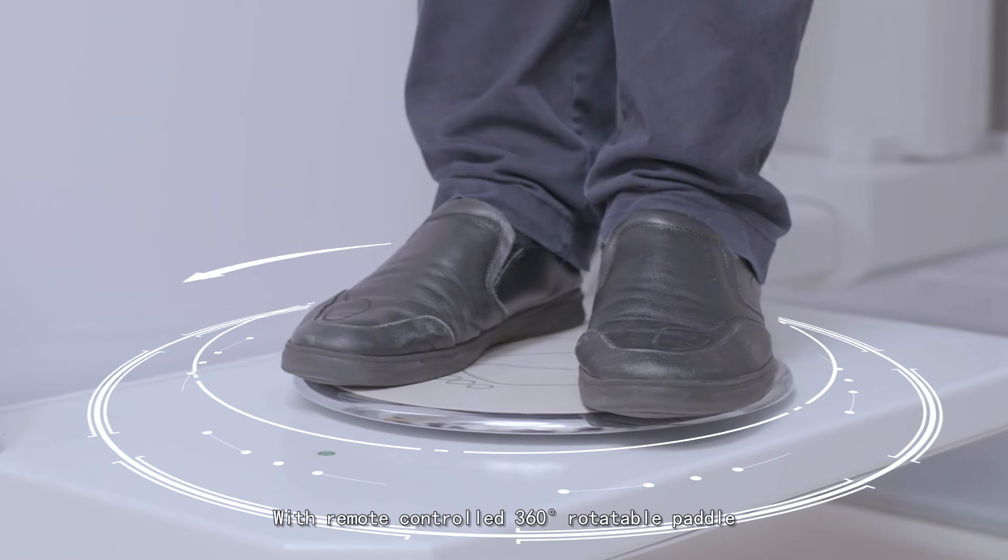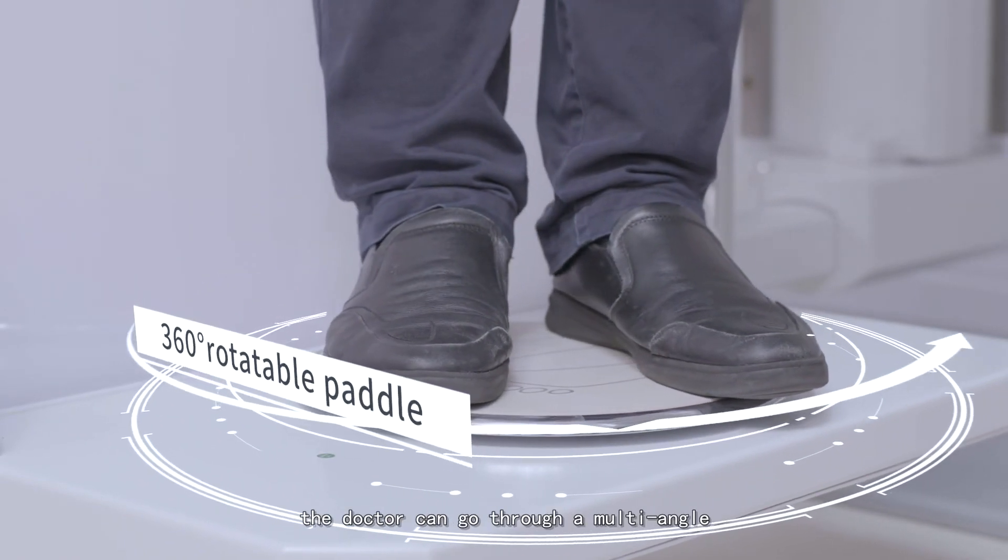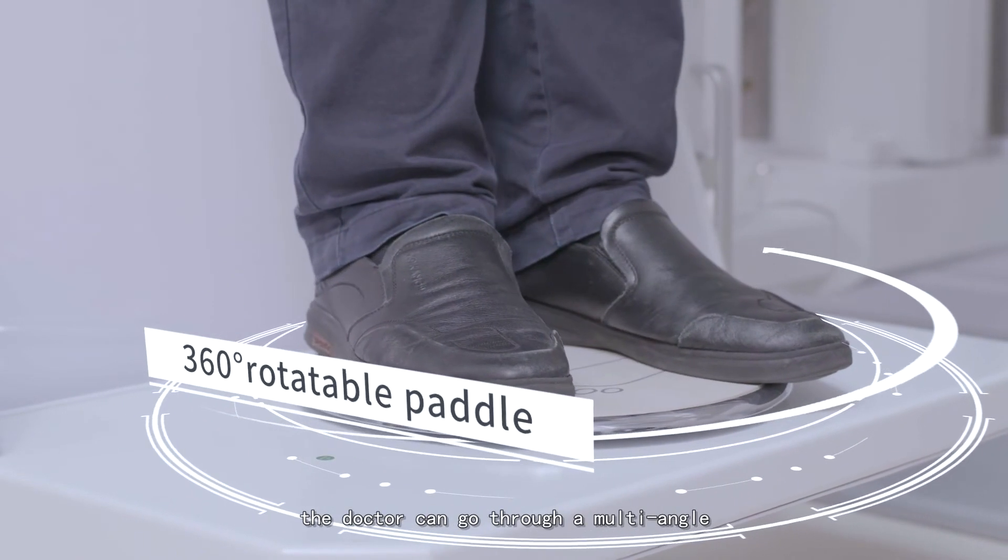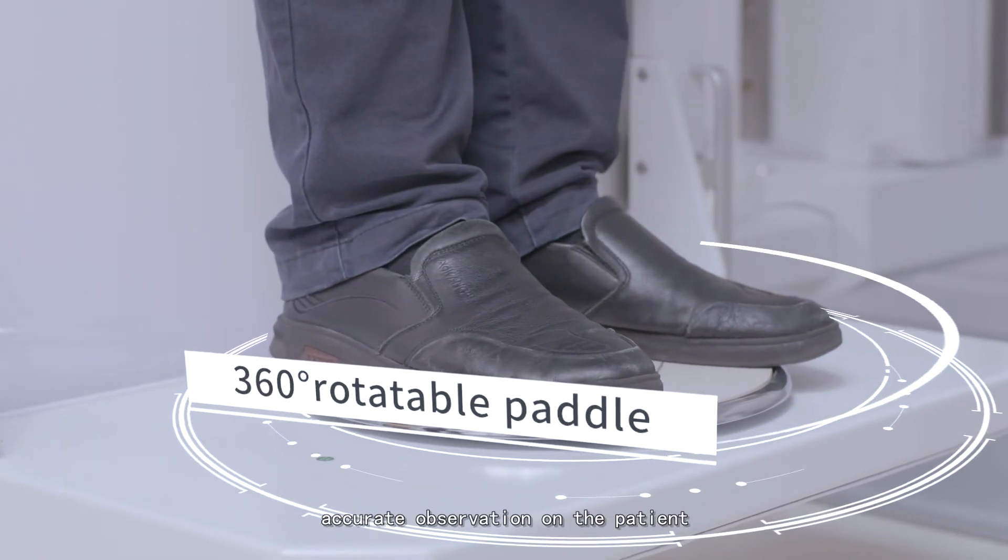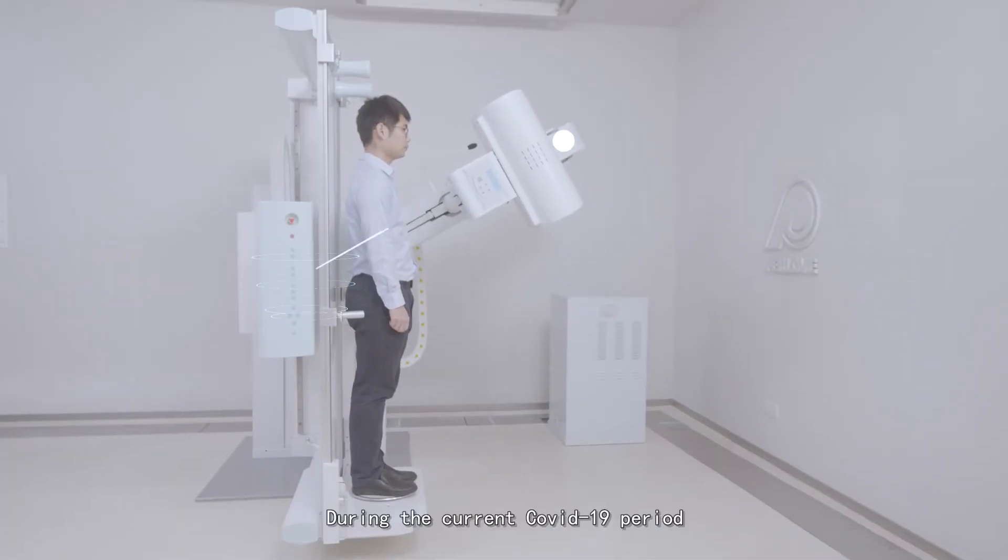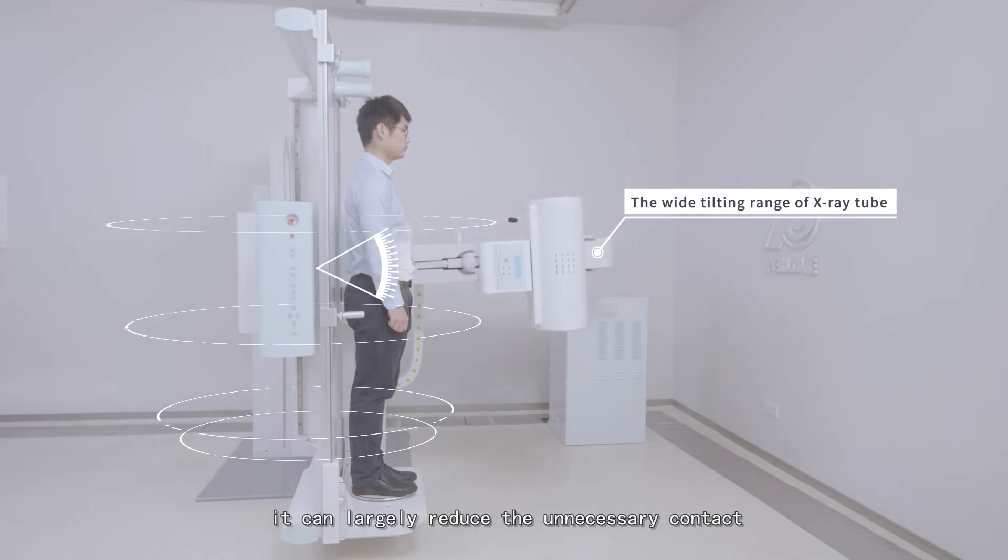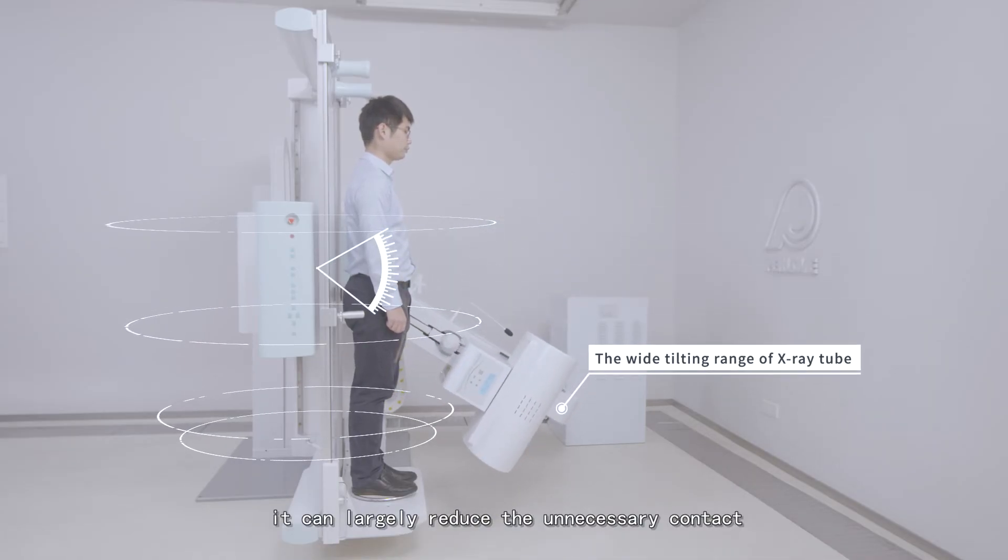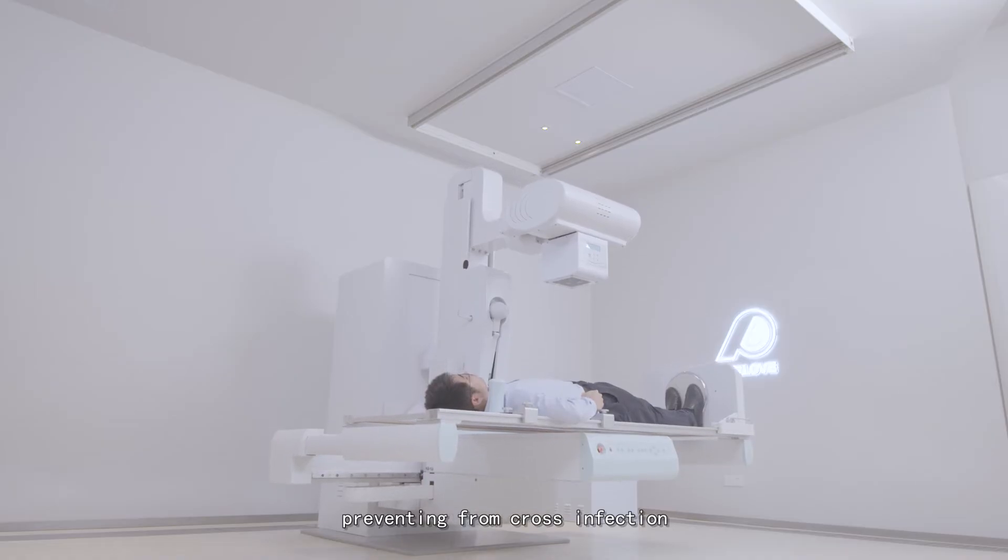With a remote-controlled 360-degree rotatable paddle, doctors can perform multi-angle, accurate observation of the patient. During the COVID-19 period, it largely reduces unnecessary contact, preventing cross-infection.